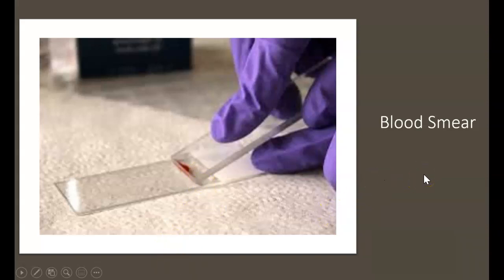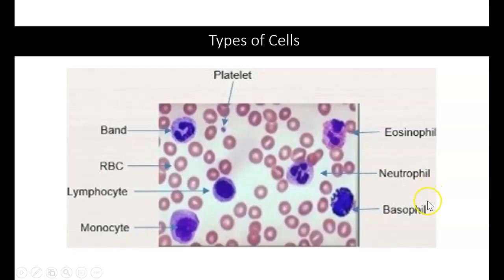When we look at a blood smear under a microscope, we are looking for a couple different types of things. We're looking at the types of cells that are present. We're looking at the number of those cells in comparison to the other types of cells that will also be in there. And then we're also looking at the overall shape and sizes of the cells.